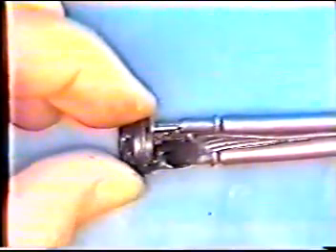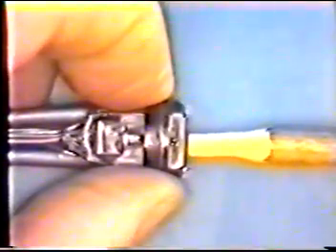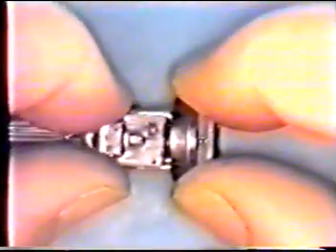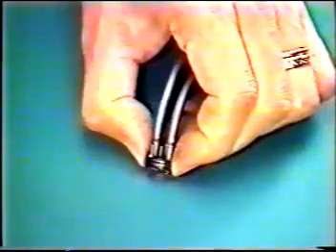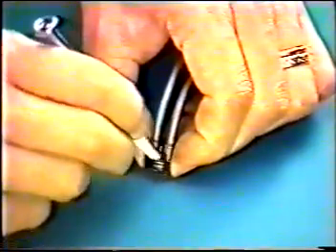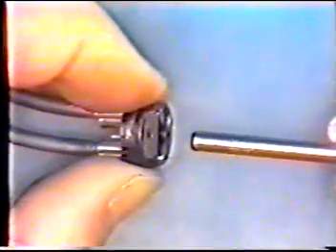Loosen screw which secures CHA. Peel off sealing compound applied around CHA as clean as possible. Push the lens surface of barrel assembly with a wooden stick into distal end. Pull out CHA from distal end. Clean up distal end. Check for any sealing compound remained inside the holes of distal end.